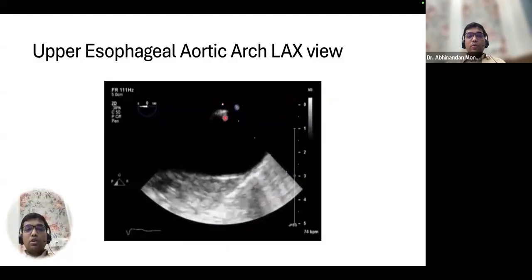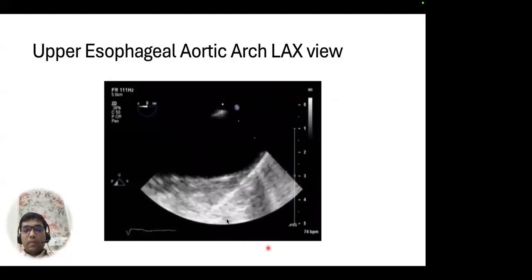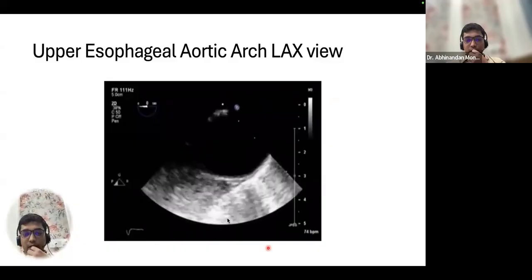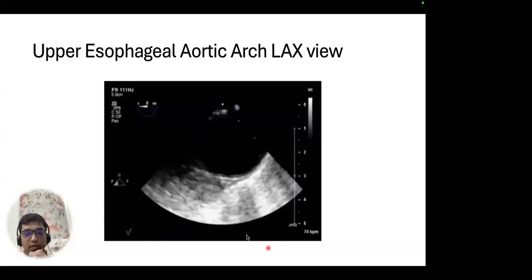So this is always your posterior wall, towards the probe, and this is your anterior wall. So I think it's clear now. Is it clear? Yes, posterior.